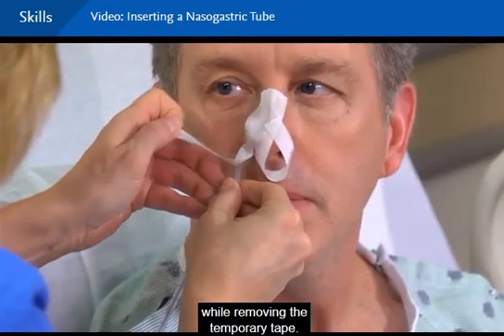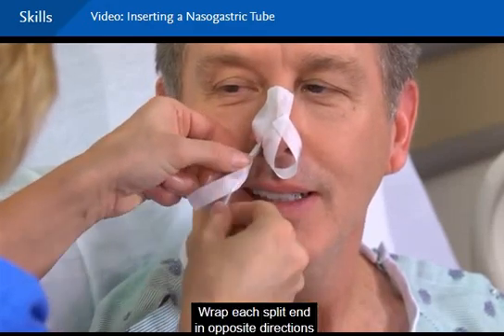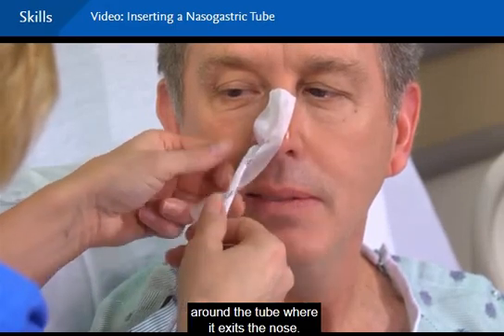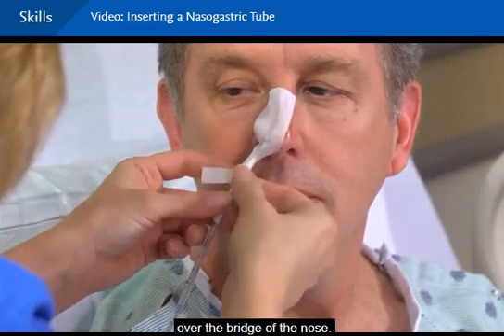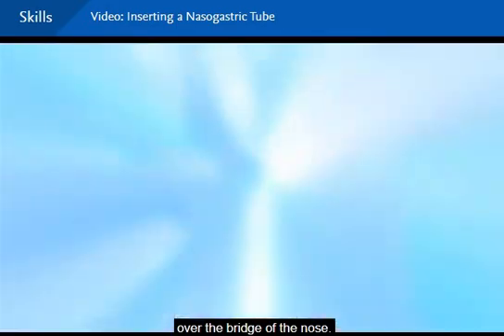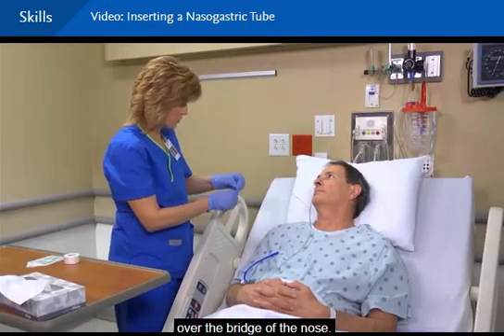Thank you for holding so still. Wrap each split end in opposite directions around the tube where it exits the nose. All right, now the other side here. Another, smaller piece of tape may be applied over the bridge of the nose. Just like that. All right, I'm just going to adhere this onto your cheek, okay?